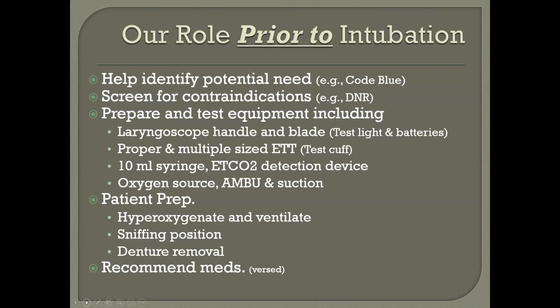End-tidal detection device, so it may be colorimetric where it changes color. The standard of care is, respiratory does a pretty fair amount of intubations at the hospital where I work. We do a lot in the 2 units I'm most commonly in, medical and surgical ICU. We have waveform. So waveform capnography is the standard of care if you have it.